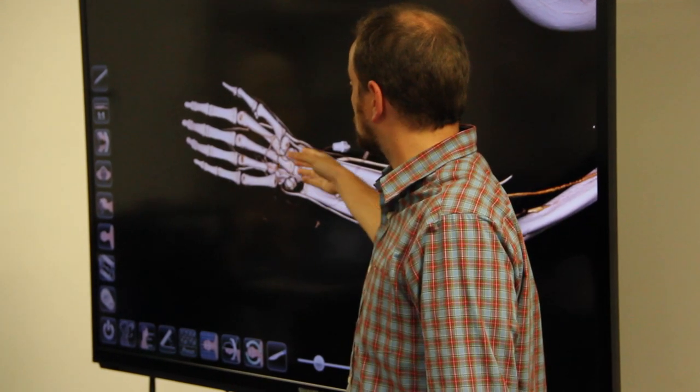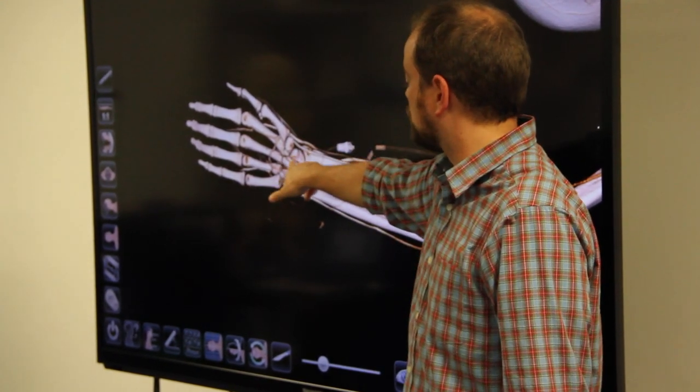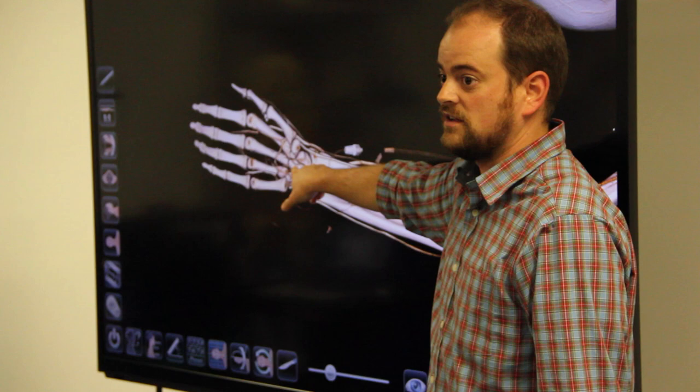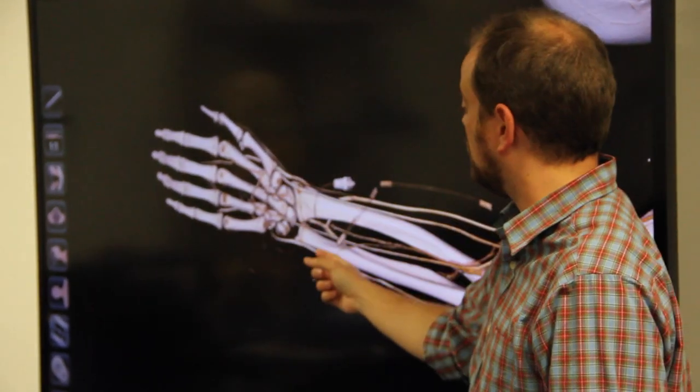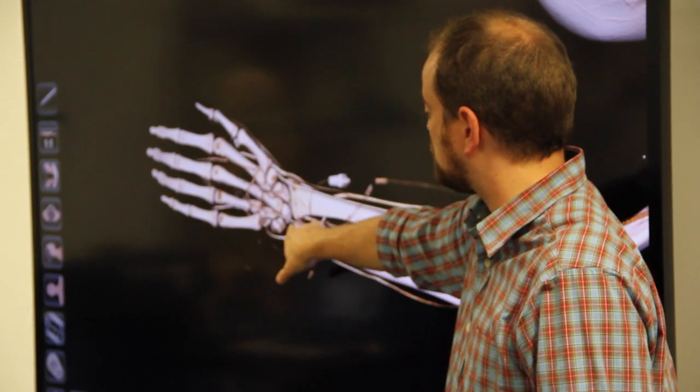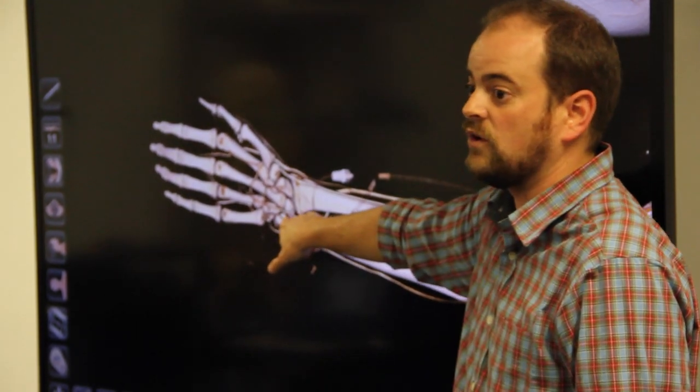But we can see that the radius is going to be attaching here towards the scaphoid and the lunate. So that's going to be the dominant bone-to-bone connection on the distal end of the wrist, whereas we can see that space for the articular disc here where the ulna would be.